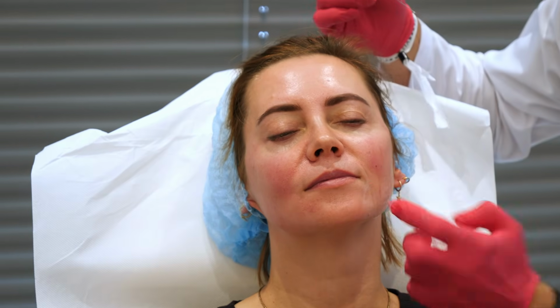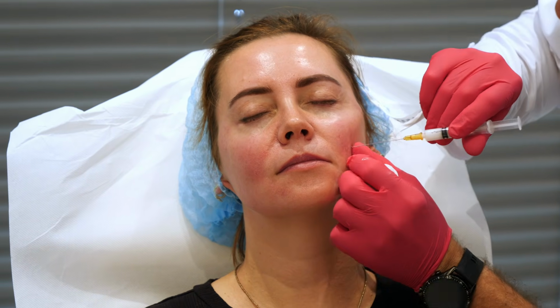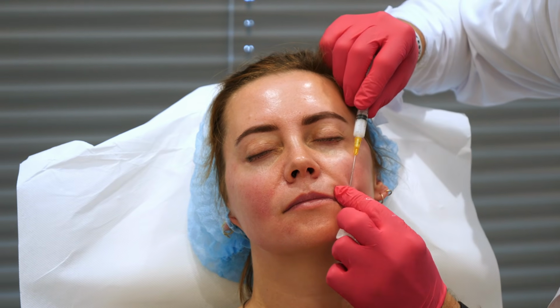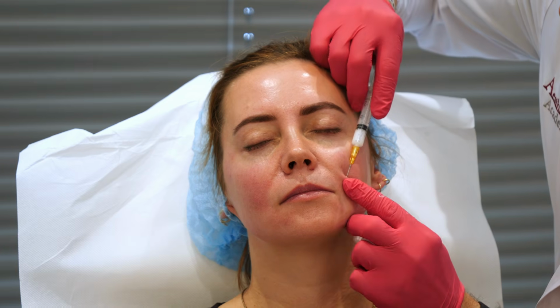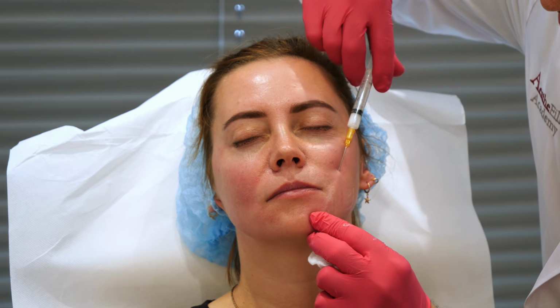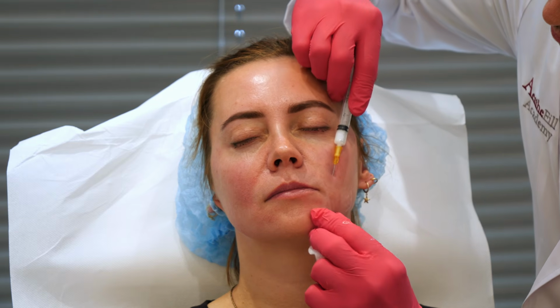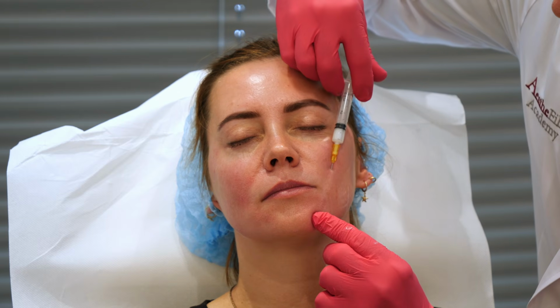Let's go to the mentalis depression from our second entry point and go down slowly. Here is the ligament, and I put a little amount of product to make an anesthetic effect. If you pinch here with the other hand, it's more comfortable for the patient.